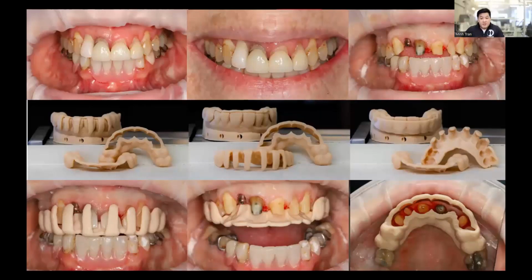So do I go about this like a caveman and duplicate things and create orders from scratch? Of course not. I just go into 3Shape, duplicate my orders and change things a little bit so I get all these different prep guides, give myself the temps, get the doctor everything. Super easy for me. The printer's doing all the heavy lifting and I just look like a superstar, right?